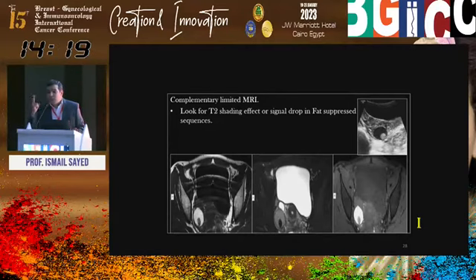So this is a double pathology, a double common pathology: hemorrhagic cyst and endometrioma. Adding a higher frequency transducer through the abdominal wall is very helpful. We can use the microconvex transducer used for cranial sonography. We can even use the transvaginal transducer, or, if the patient is slim, the linear transducer.